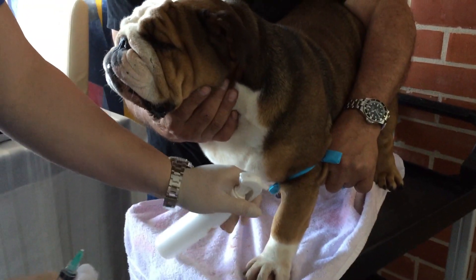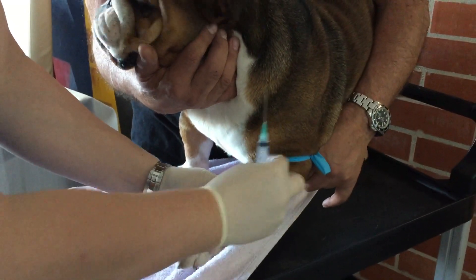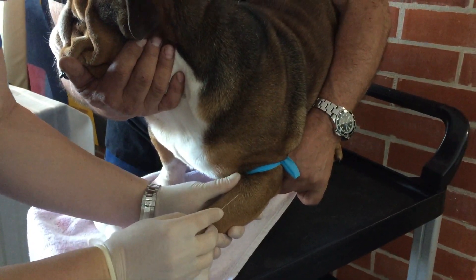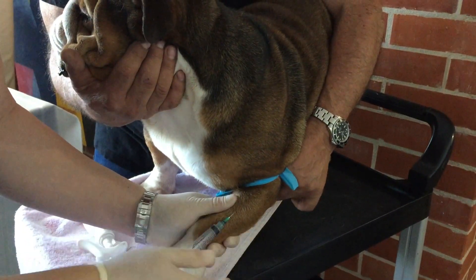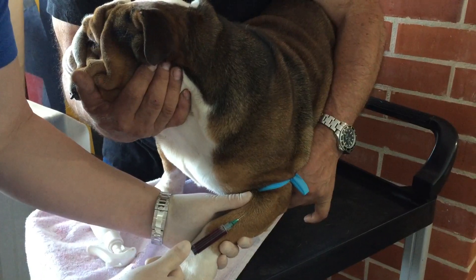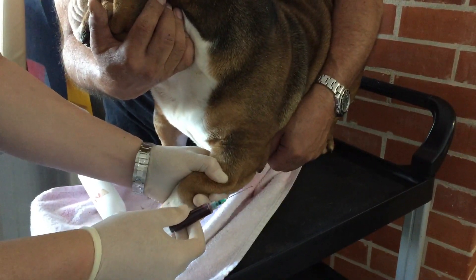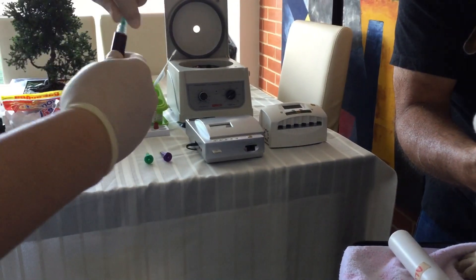We're going to collect the blood for the progesterone — you want to clean the area really well. You want the hole facing you and feel the vein, then press it a little bit until you see blood in the needle. There you go — you see it right there, then just withdraw slowly. You don't need to be poking around or pushing it — it's right over the vein. Then constrict it for a bit so no blood comes out and you're done.